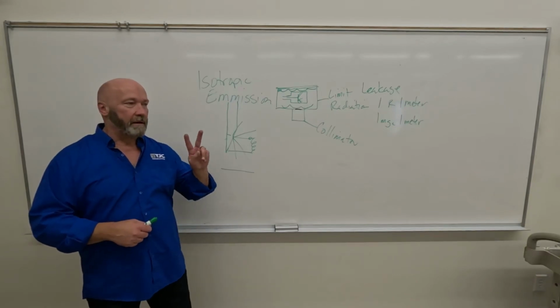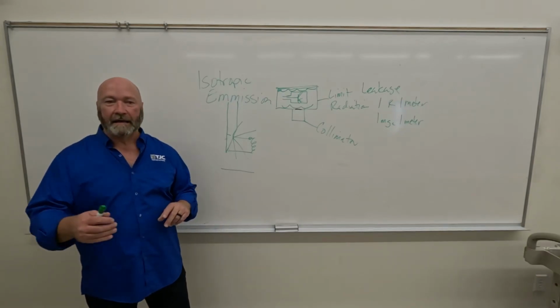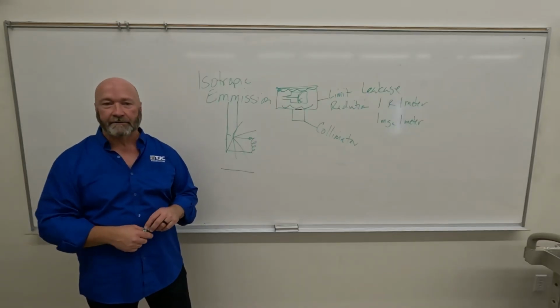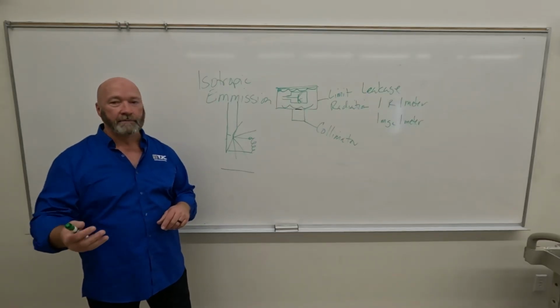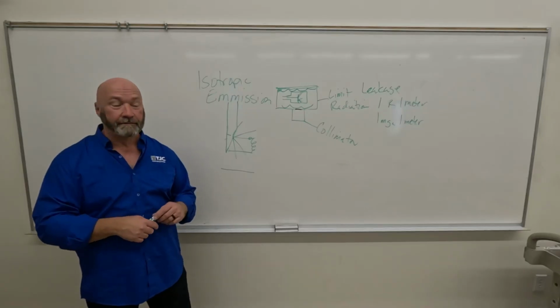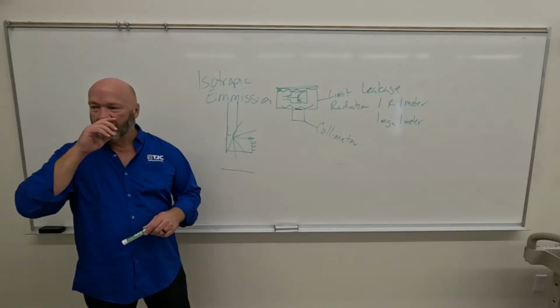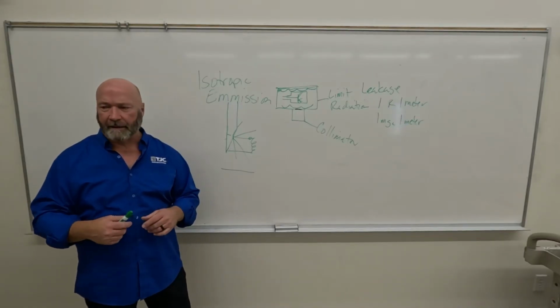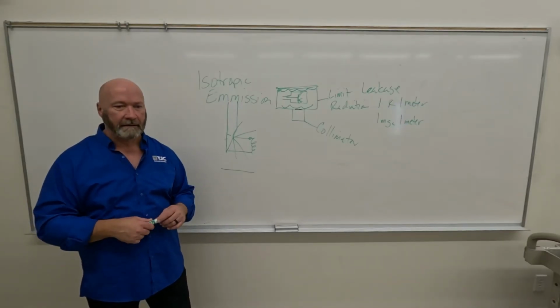There's only one of two reasons it would come out exactly half: one would be erratic exposure because of a gassy X-ray tube, and the other is because your rectifiers fail. That's something that I talked to somebody about after class, I think after the test.